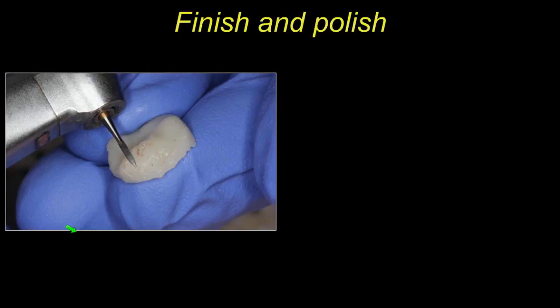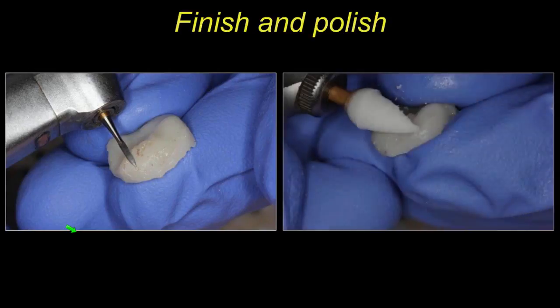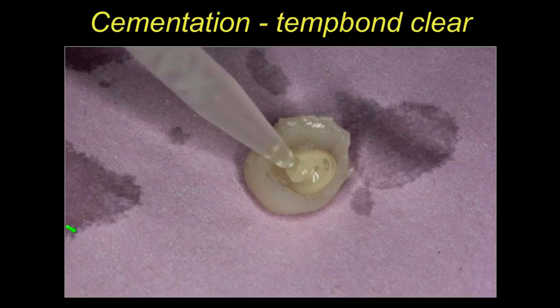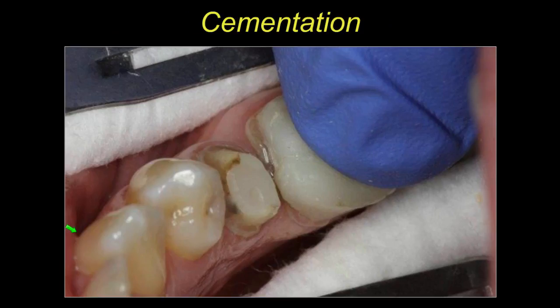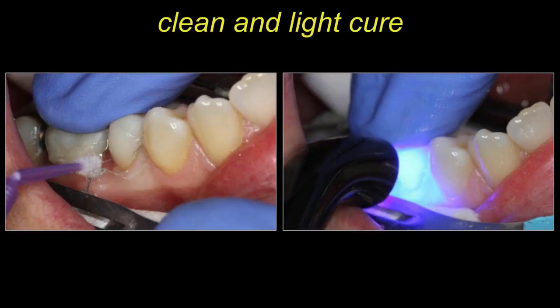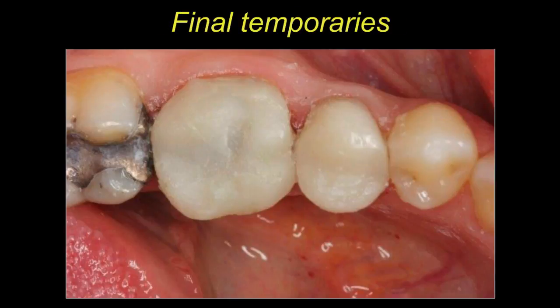I'll trim excess with a multi-fluted carbide bur, then polish with an enhanced polisher. Once it's in, I'll try it in, check the occlusion, then use Temp-On Clear to cement it, removing excess with a micro brush. Make sure you get rid of all the Temp-On Clear — it tastes terrible if any residue remains. Patients will come back the next day complaining of a horrible taste. It works well but you've got to get rid of it completely.